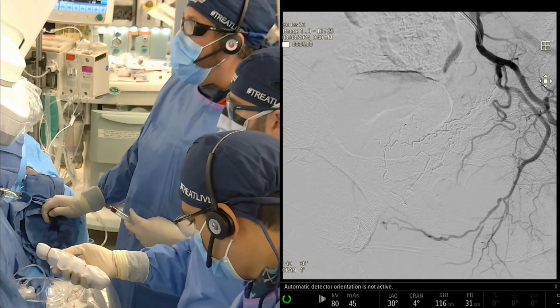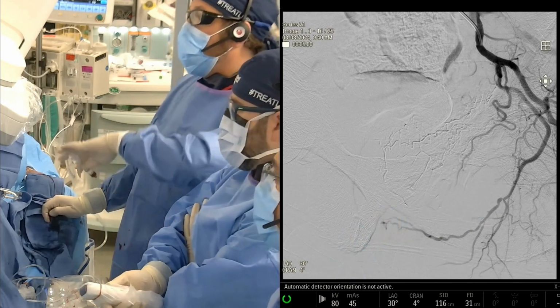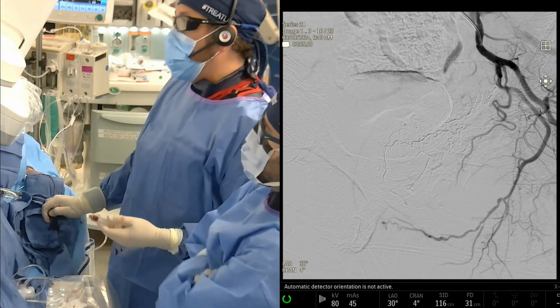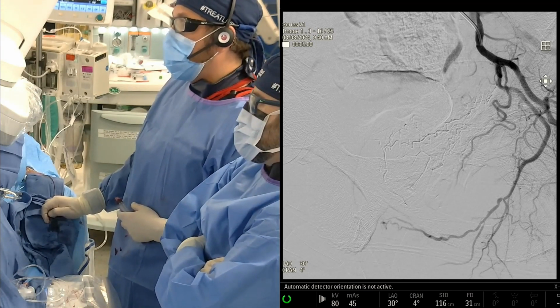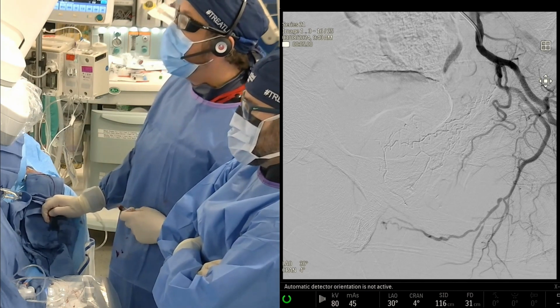And we actually didn't take out the rectal, which we probably could have, at least as we injected glue and pulled back. We probably could have taken out that rectal proximally, but we didn't need to in this case because we were so distal in that vessel. And so that's about as good as we could expect. That side is a fantastic result. That's a perfect result.